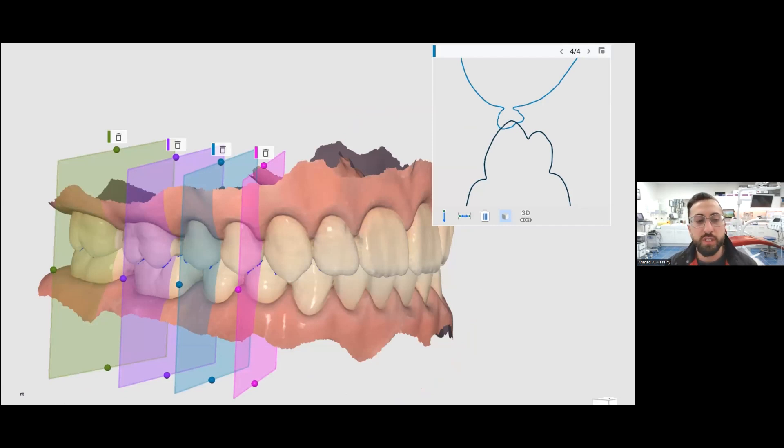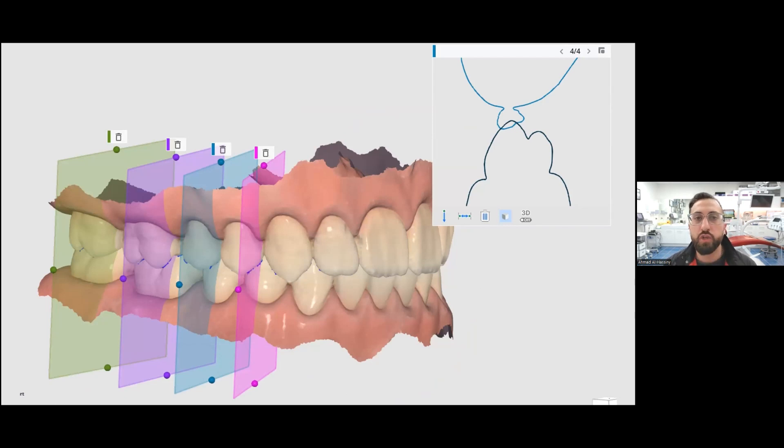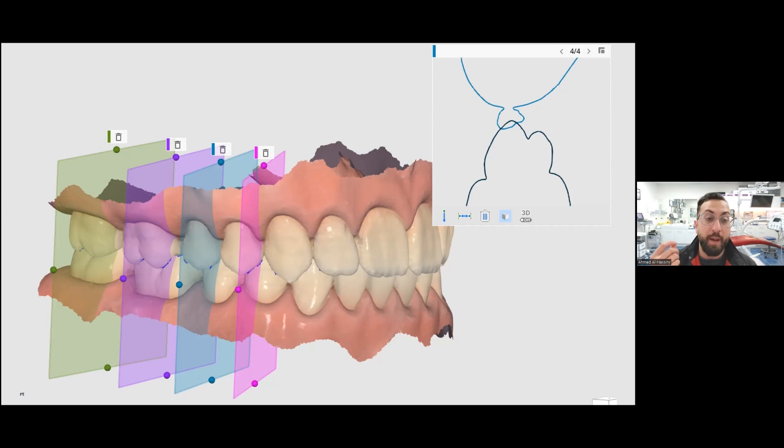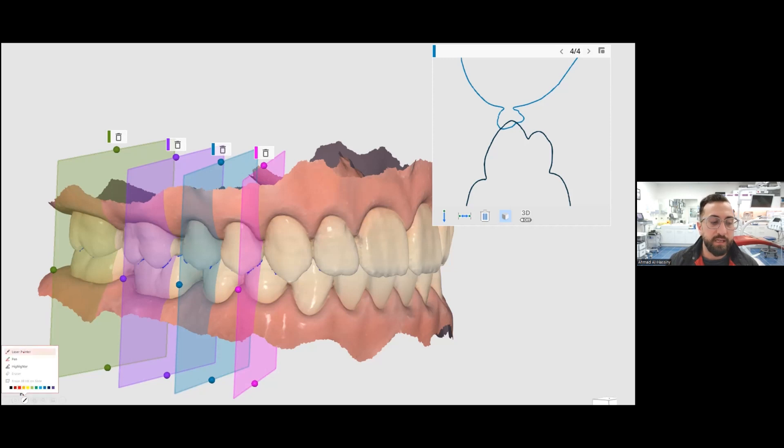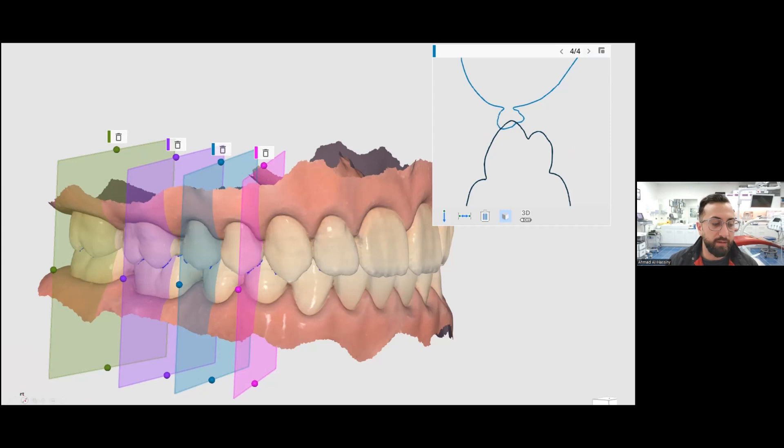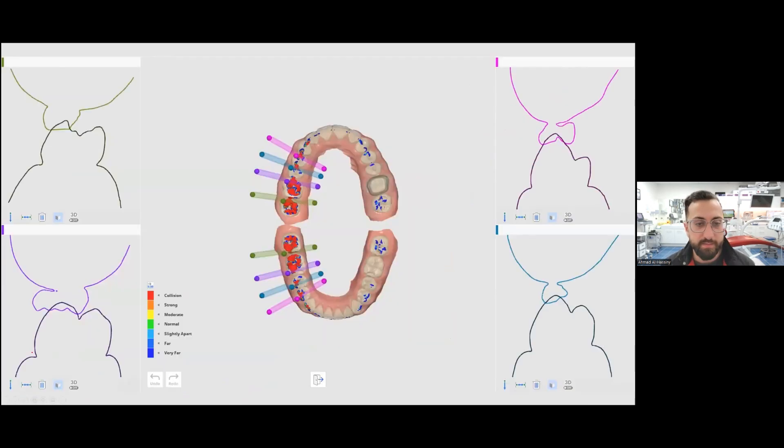Do I do this? No, I don't do this every case. And really, you should only do this, I would say, if you have a big concern. But it's good to have this tool in here. As you can see with these intersection lines, if you look on the right side, you can see there's clearly an intersection here. And that is obviously not how the patient's bite is.